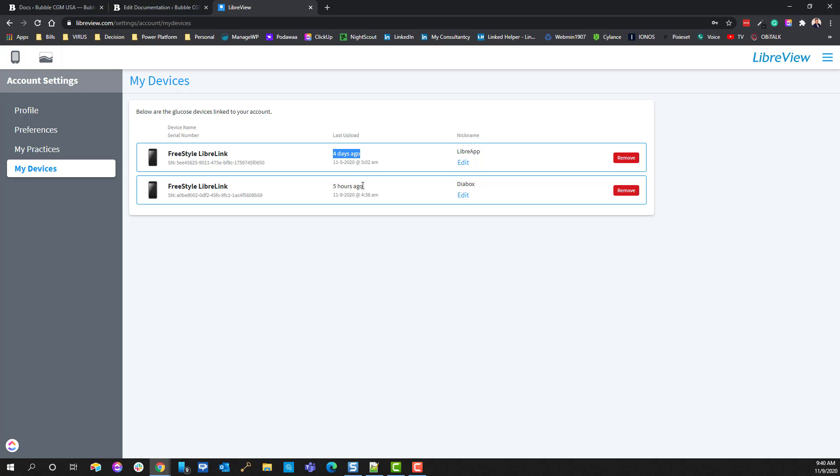Right now, the way that it's working, and it didn't always used to work this way, you can only have one app on a device logged in at any one given particular time.